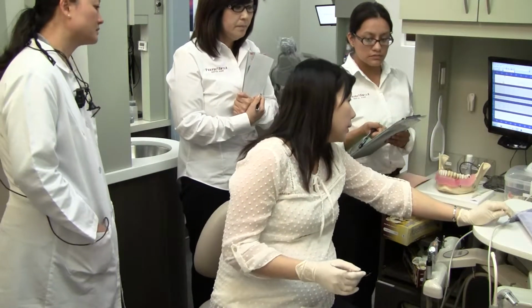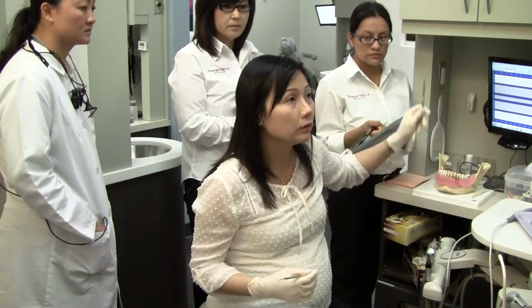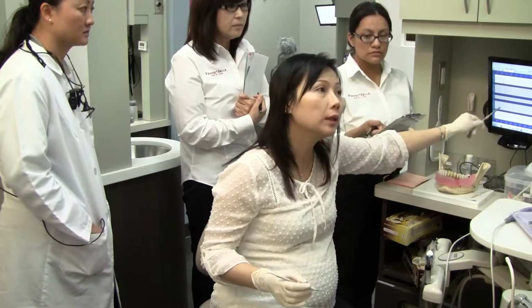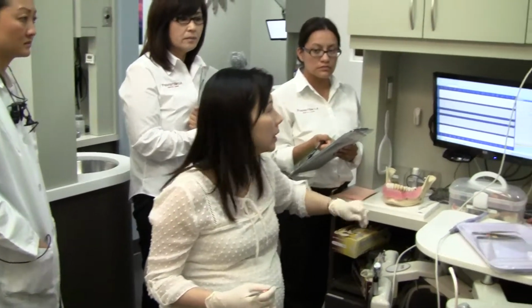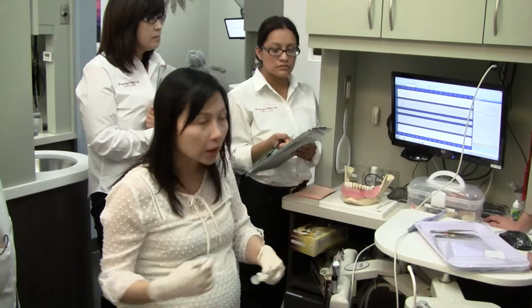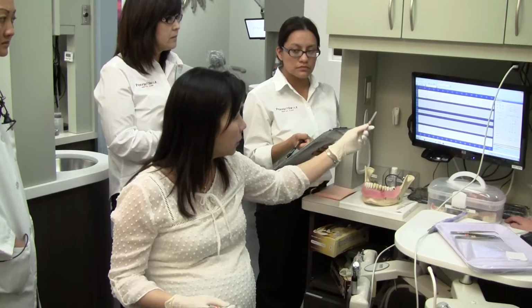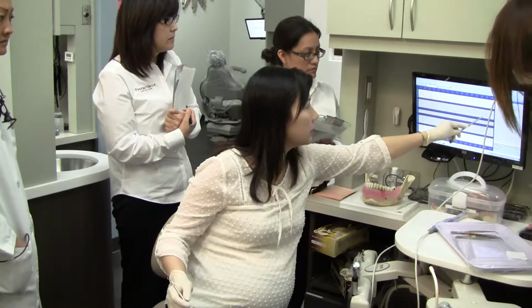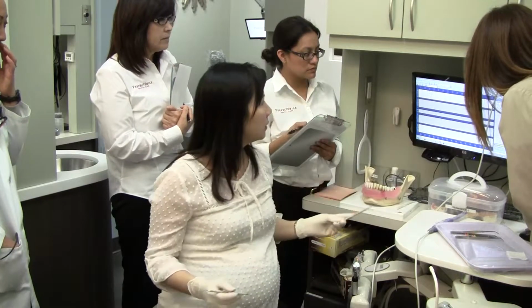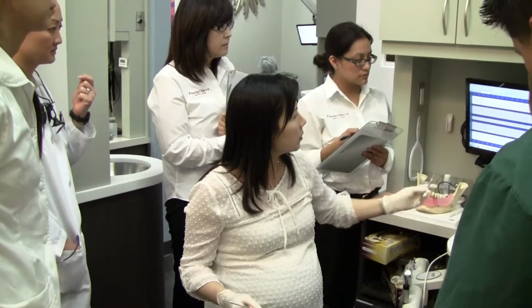So at this point, David, I'm reading out the numbers. The assistant knows which one. You don't have to tell me what's next. You don't have to tell me the tooth number next. I'm just gonna read it along, right? And then just read out 4 sets of numbers. 3, 3, 3, and then lingual, distal lingual here. All right, 4, 3, 5. It's number 14.